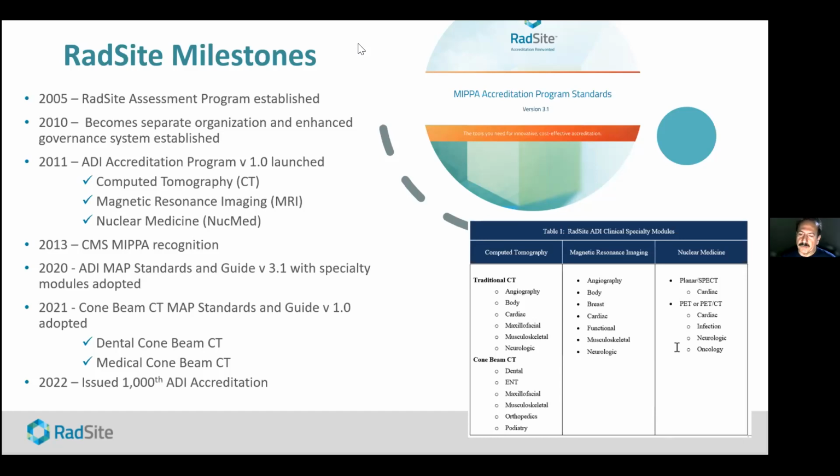When we look at cone beam CT, there are multiple different categories that we recognize. By far the most common is dental cone beam CT, which is rapidly becoming the standard for dental imaging in comparison to PanRx and other more specific imaging of the teeth, because the doses that are utilized are pretty comparable to conventional dental imaging.